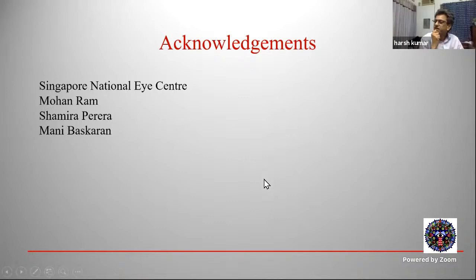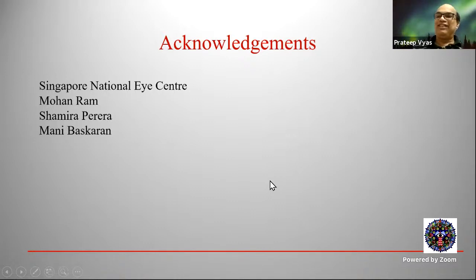Yeah. Thank you, Arun. Wonderful. We have been discussing AS-OCT for almost 15 years, and I learned a lot from you. It was a fantastic lecture. Amazing. Thank you, sir. But for the PGs, all these technologies have their own role to play in practice. Gonioscopy is most critical, and obviously there is no substitute for gonioscopy. But the other technologies are complementary. There are many situations where you have to use the UBM, the AS-OCT, or where the Retcam might be very useful. If you want to visualize the retro-iris structures, obviously gonioscopy cannot do that. If you have a corneal scar, gonioscopy cannot see the inside structures. So in these patients, this technology does help a lot.